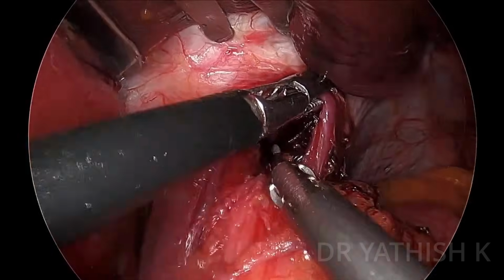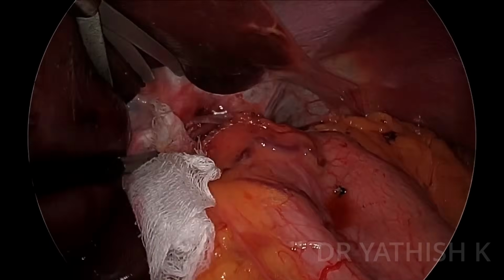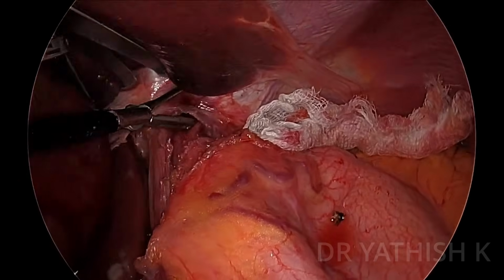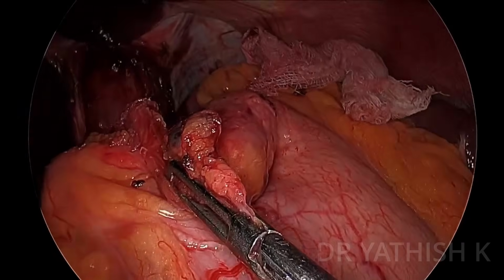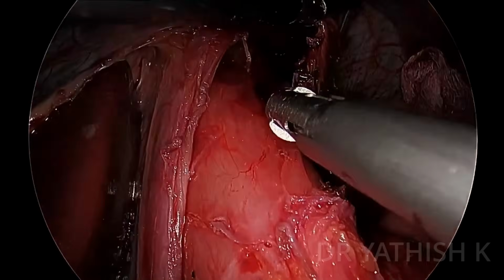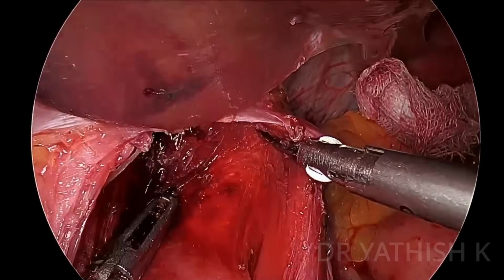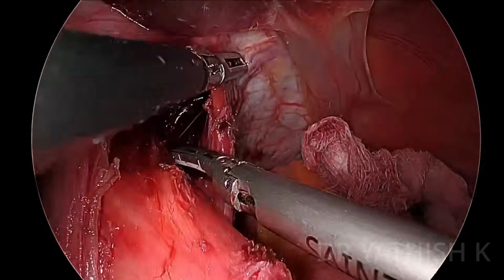So now that the fundal mobilization is almost done, our focus is shifted towards our thoracic part, where we have to identify the anterior vagus nerve. The reason why we have to identify the anterior vagus is when we do the myotomy, we don't want an inadvertent injury to the nerve and then lead to nerve transection. So that is your anterior vagus nerve.